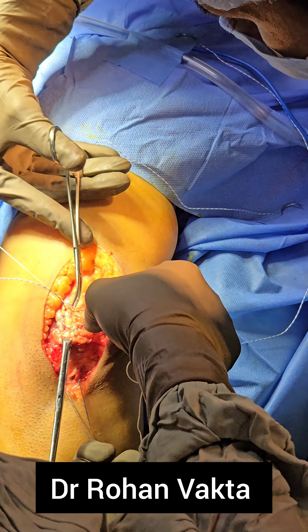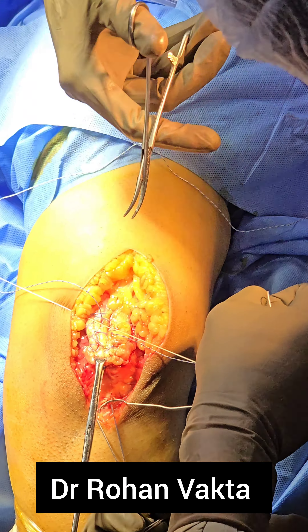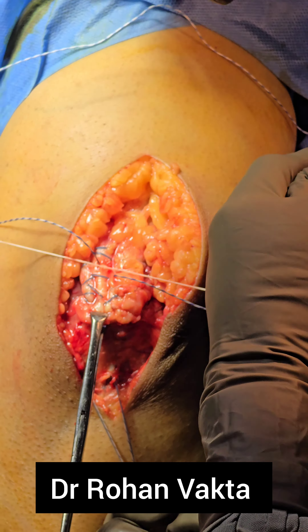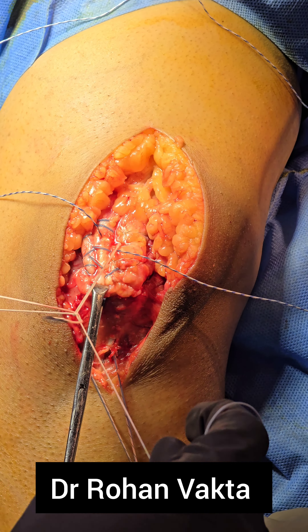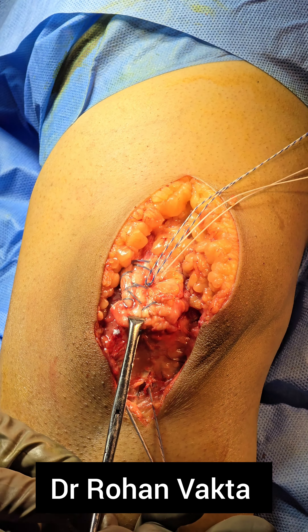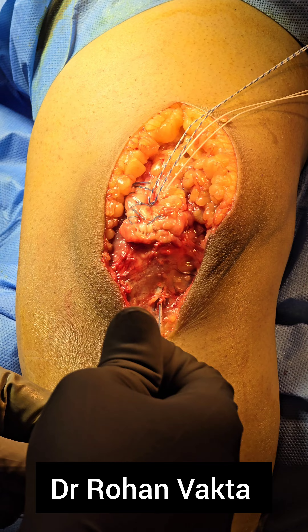Ask the assistant to keep pulling the transosseous fiber wires while you tie down the suture anchor fiber wire. One by one, the fiber wires of the suture anchors are tied so that the triceps tendon is reduced completely into position. However, if you observe carefully, even after tying the suture anchor fiber wires, the edge of the distal most part of the triceps tendon keeps elevated.